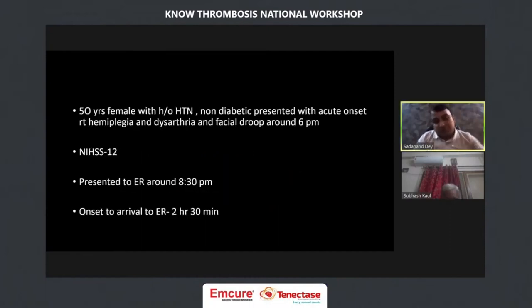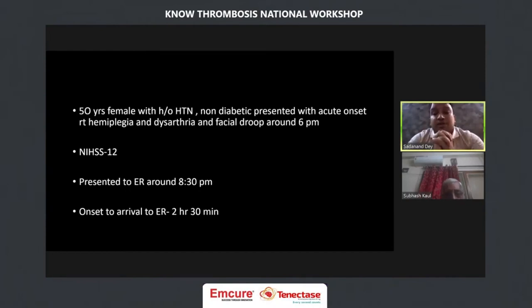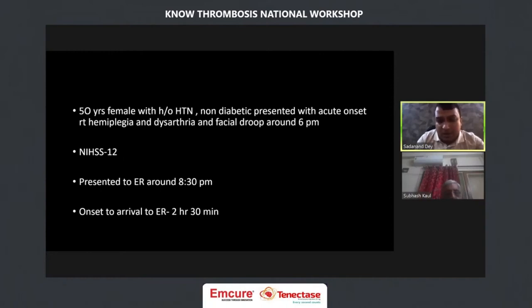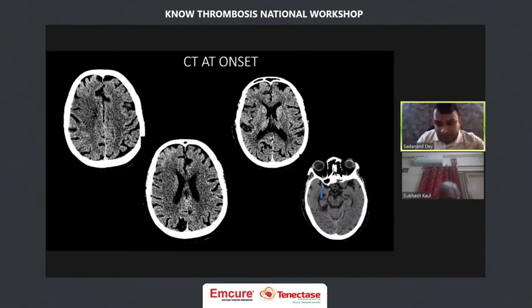This was a story of a 50-year-old female with a history of hypertension, non-diabetic, who presented with acute onset right hemiplegia, dysarthria, and facial weakness around 6 PM. NIHSS was around 12. She presented to the ER around 8:30 PM, so onset to arrival was around 2 hours 30 minutes. This was the CT at onset.